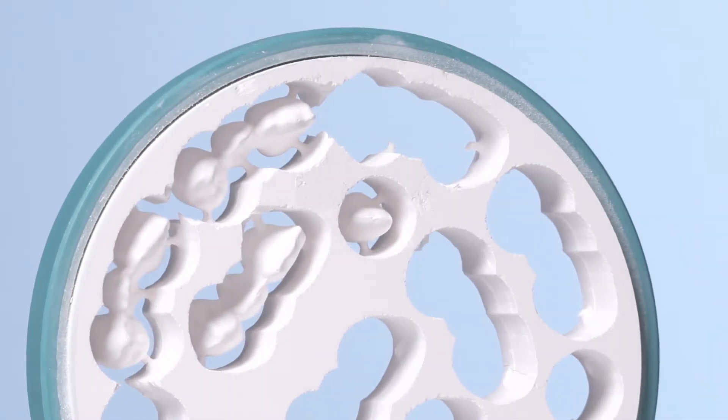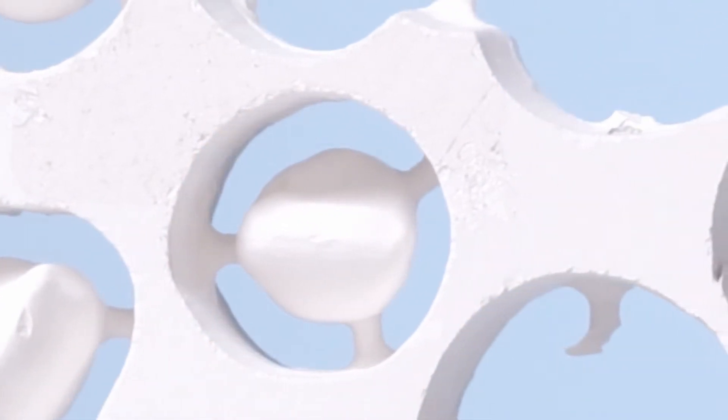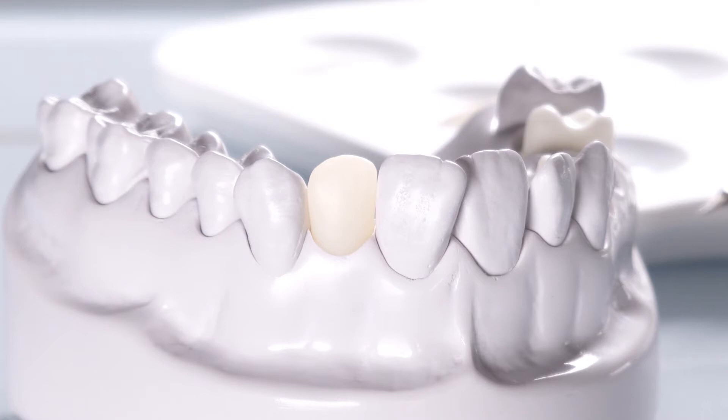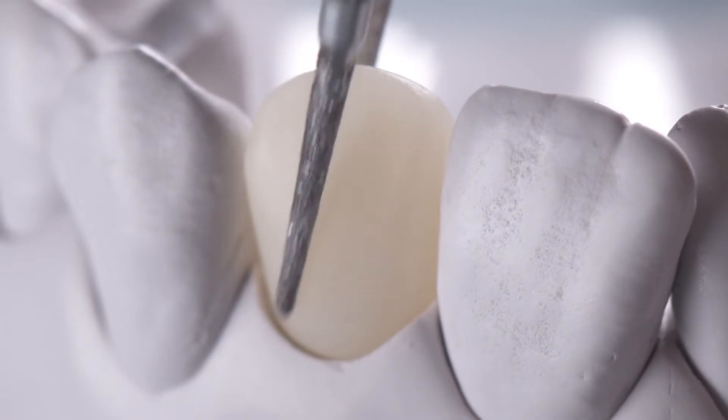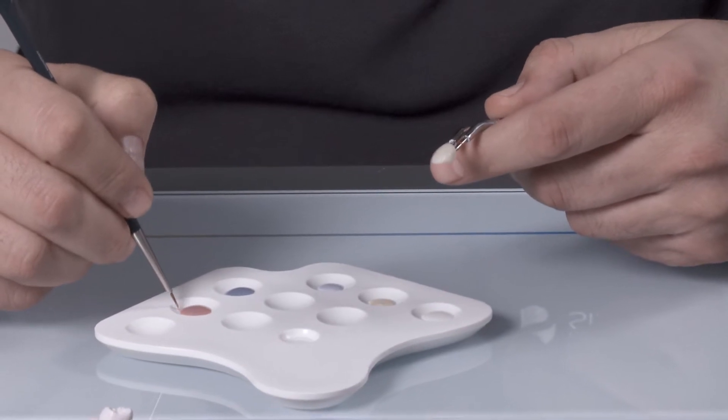The extra-translucent Sirkon XT Zirconia material provides a high level of aesthetics with monolithic restorations. All that is required is a final customization with universal stains and glaze.